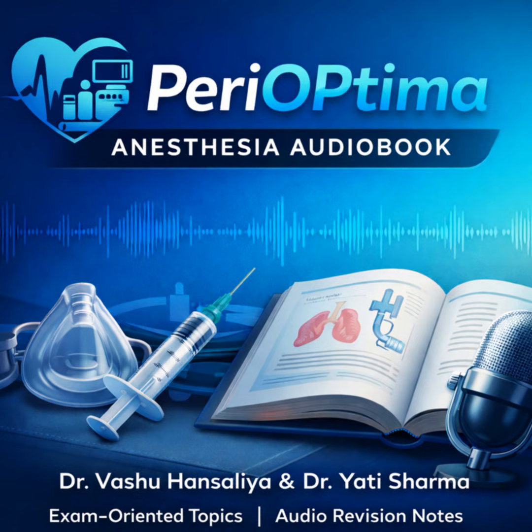Perfect. So if we're looking at the big picture, the highest level distinction is based on how you actually see the larynx, right? The technique itself. That's it. And that immediately gives you two main categories. First, you have the direct laryngoscopes, the DLs. The classics. These use a rigid instrument to literally create a direct line of sight from your eye to the glottis. You're physically moving tissue out of the way to see.